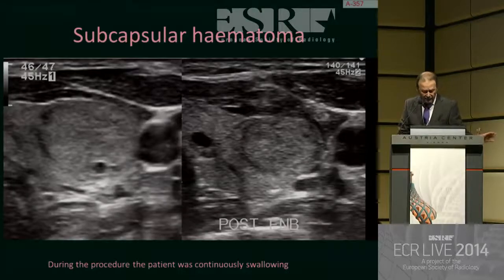We always say to the patient to stay outside the room. In this case, we ask the patient to stay at least 30 minutes compressing the point, and after those 30 minutes, I check with ultrasound how it is going. In my experience, it has always been self-limited and even smaller.